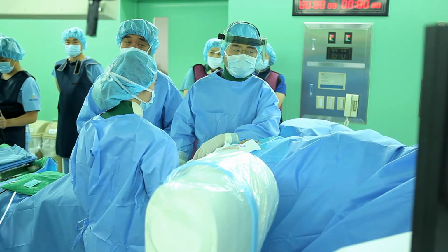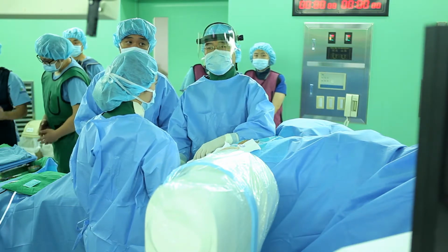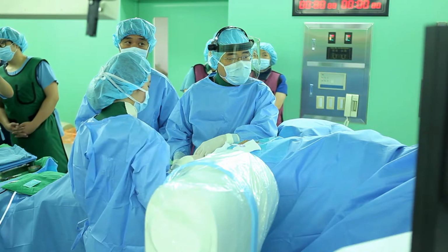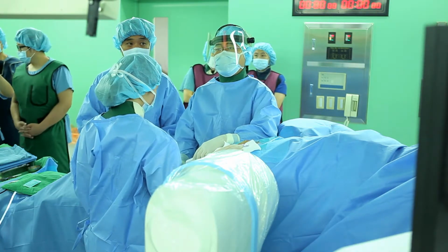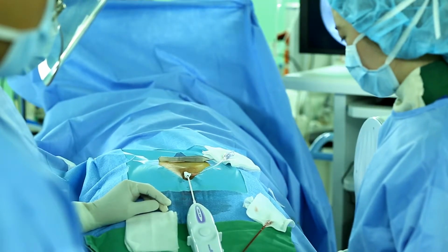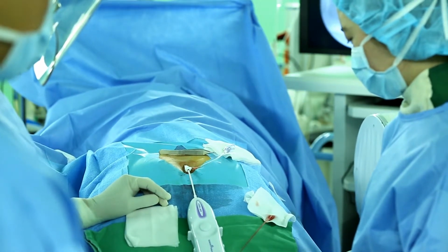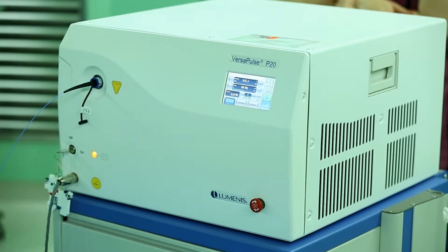The patient may complain of an intolerable heat sensation, although the laser fiber is not touched to the nerve, while having been injured by thermal energy. Then, you should irrigate saline to cool down the temperature around the nerve. This is an additional tip for you.